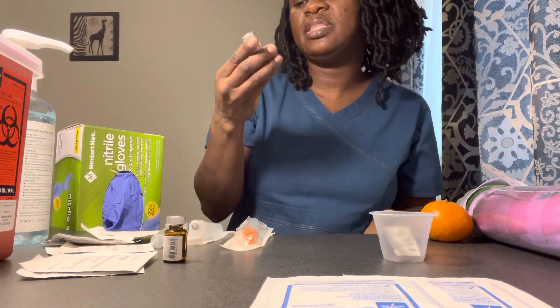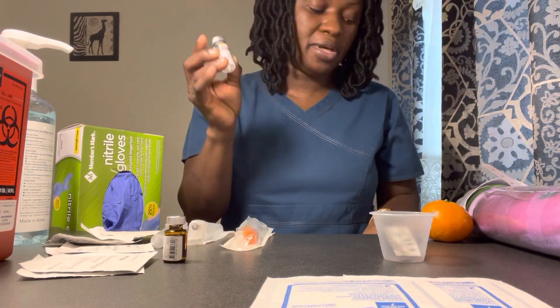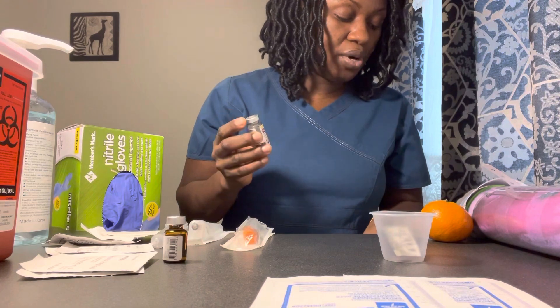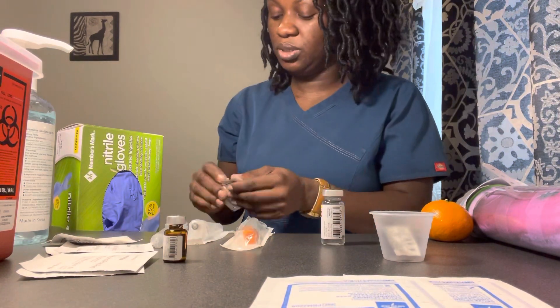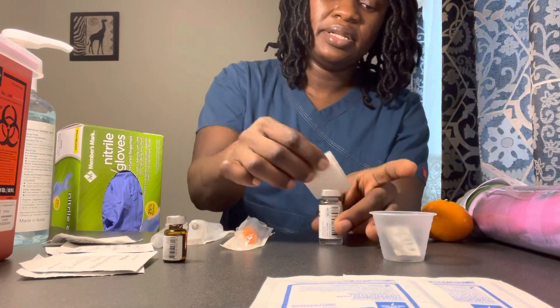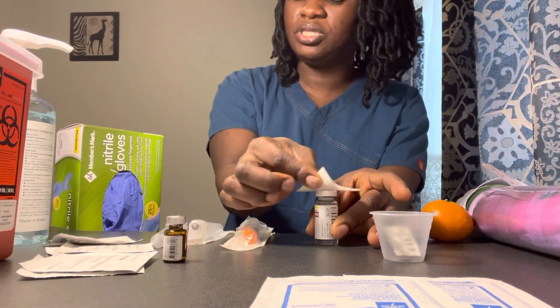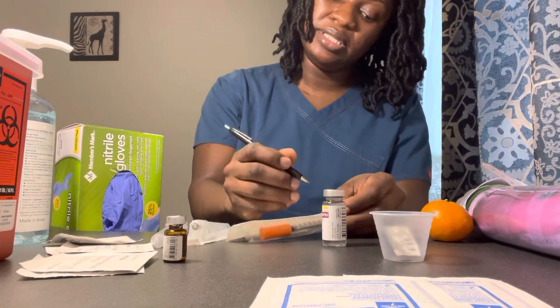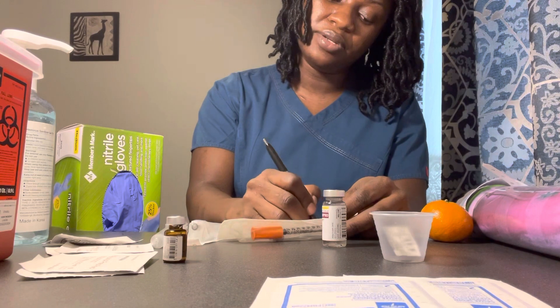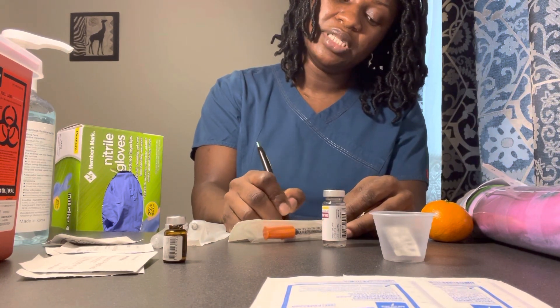Next is my insulin Lispro. I have my insulin Lispro — this vial contains 100 units per ml, and the order is for 10 units. Let me go ahead and grab my alcohol swab and clean the vial. Make sure it's clean. I will write the name of the medication and dosage: Insulin Lispro, 10 units, subcutaneous.